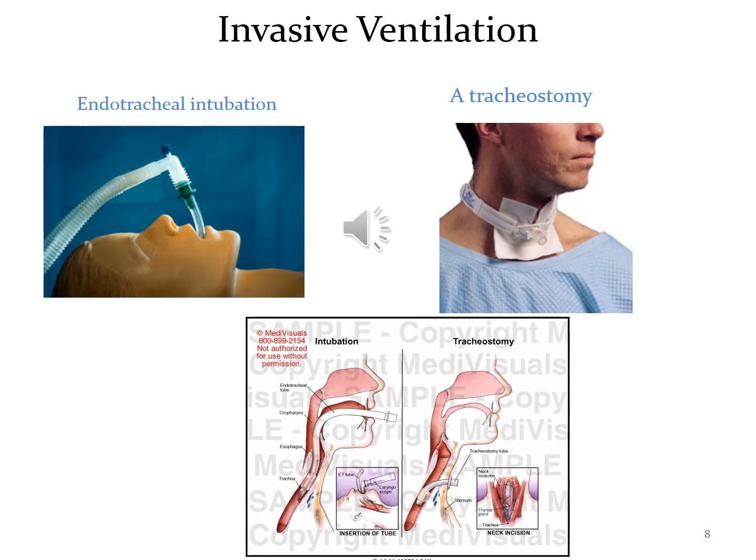Invasive ventilation: a plastic tube inserted into the trachea. A tracheostomy is a surgical procedure to create an opening through the neck into the trachea. A tube is usually placed through this opening to provide an airway. This is done for long-term care of the airway.